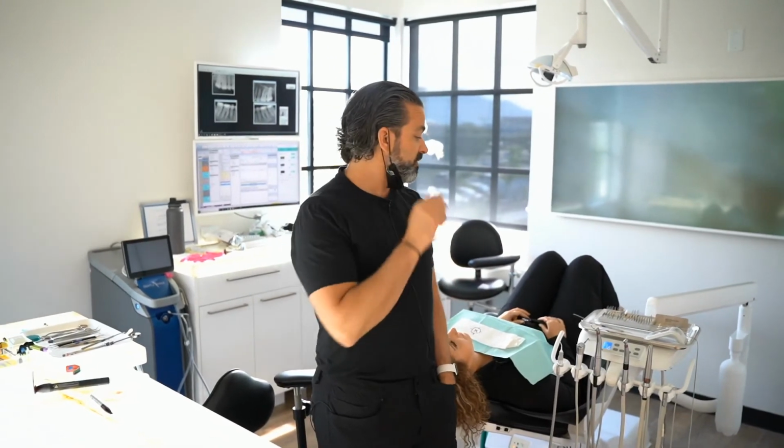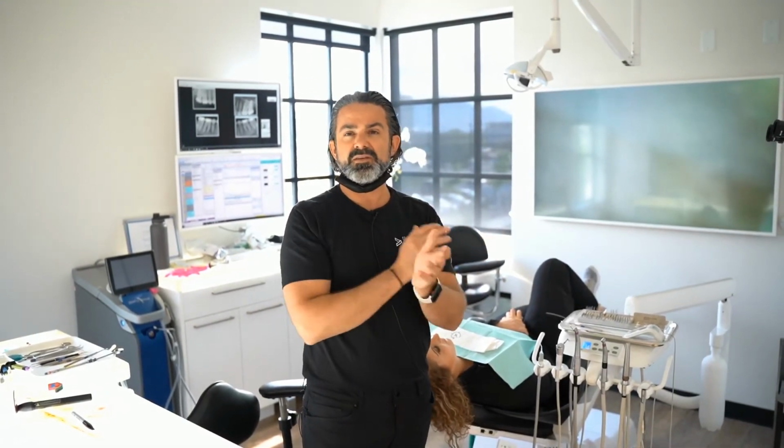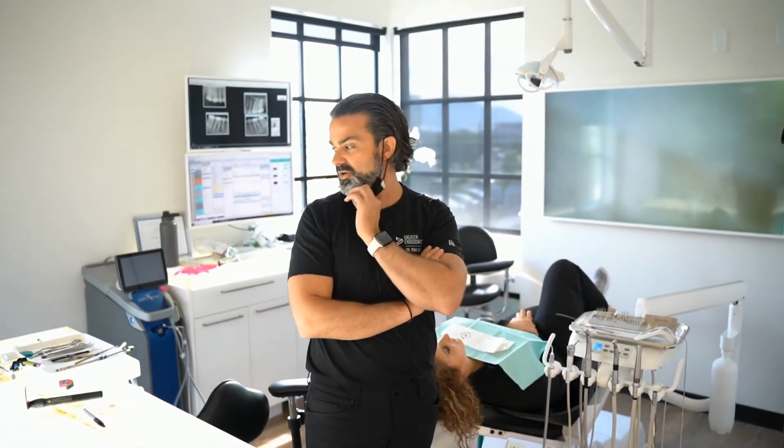Oh, it's too bad I am not doing a crown prep for you guys. Crown prepping under a microscope is phenomenal, because you can see the shadows and you can see the details of your crown prep in a way that I can't really explain unless I could show you.